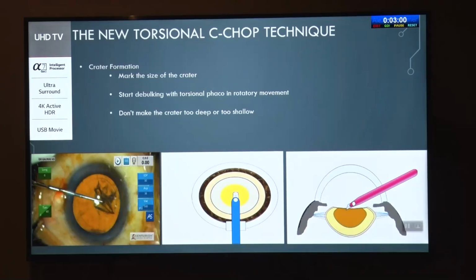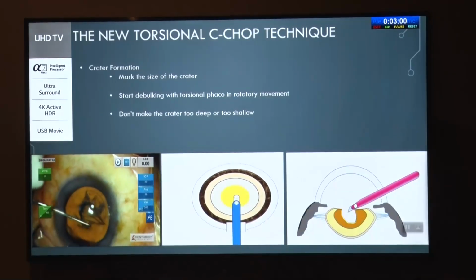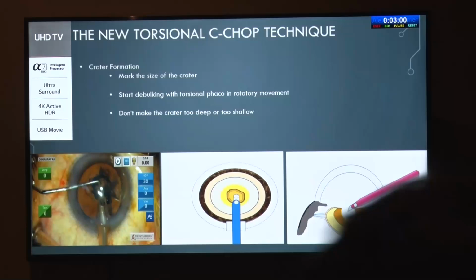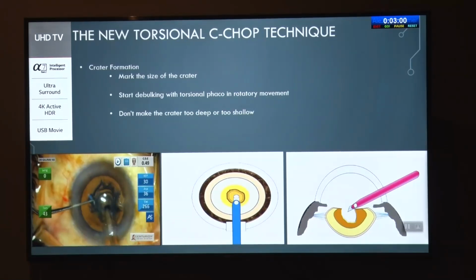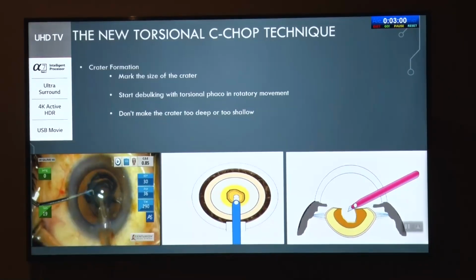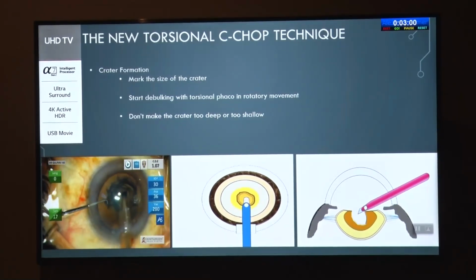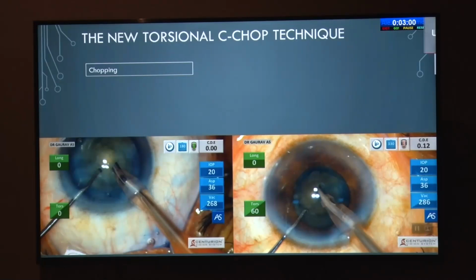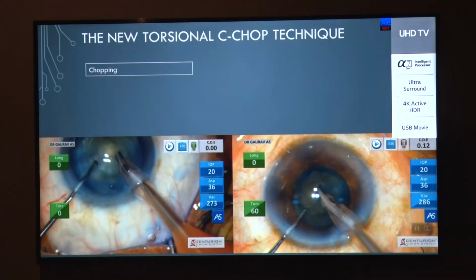So this new technique involves making the rhexis 5.5 millimeter, marking a center 2 to 3 millimeters with a Sinskey hook, not with the sharp hook, using the thickest part of the nucleus, which is the most difficult part to crack, and deepest part, just debulking the central part using just the torsional phaco and making the crater depth of adequate size to have an idea about the thickness of the nucleus without putting stress on the zonules. This technique can be applied to all types of cataract from grade 1 to grade 4 without going into the periphery and utilizing the central thickest part and the central deepest part of the nucleus.